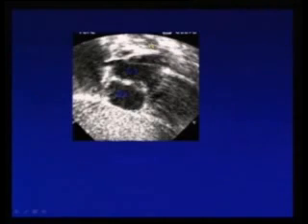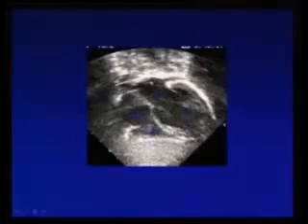Aorta, descending aorta always goes with the left atrium. So in the fetal echo, we identify LA by the descending aorta. An additional feature: suppose it is situs inversus, the descending aorta comes to the opposite right side. So this is the descending aorta, and as I go anteriorly from that plane, this is left atria joining left ventricle, right atria joining right ventricle.